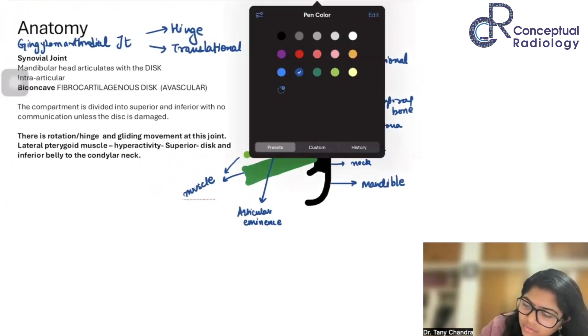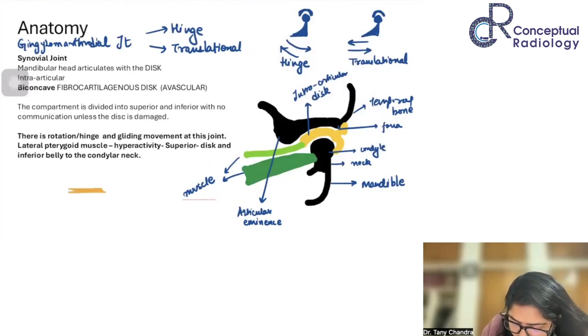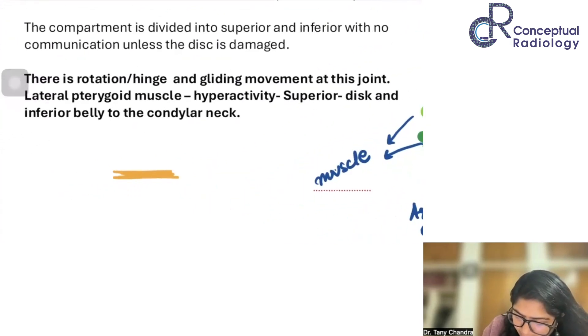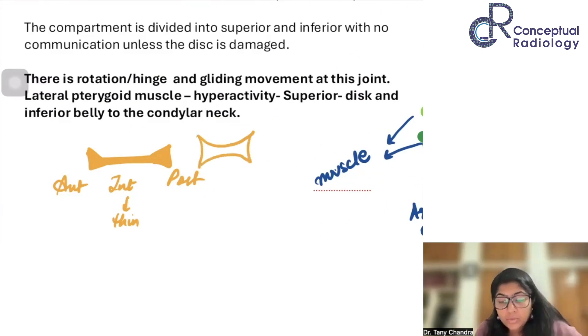Let us look at this disc a little more closely. What happens is that this disc has an intermediate part. It has an intermediate part. It has a thick anterior part and a thick posterior part. So, anterior, intermediate and the posterior part. This is the thin part. And now you can see that it's more like a bow tie kind of a thing. This is like a biconcave disc shape. This is how a normal disc is supposed to look like.